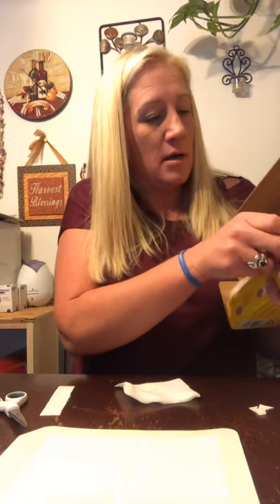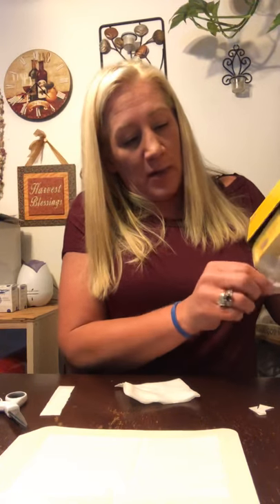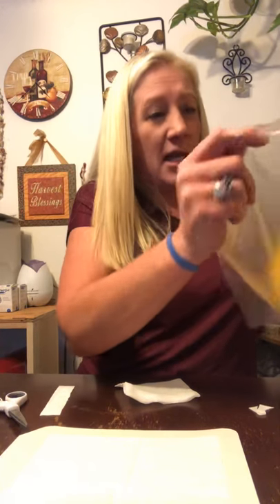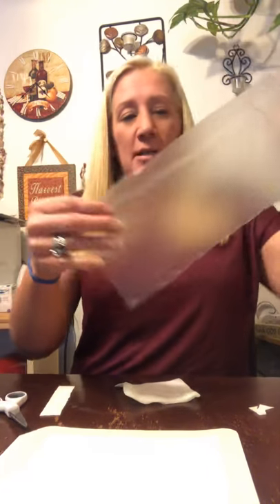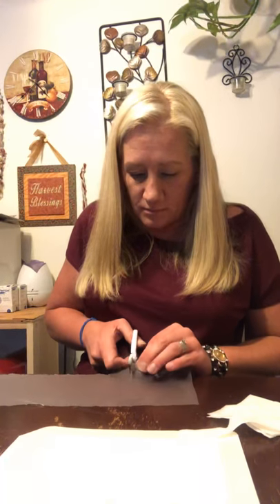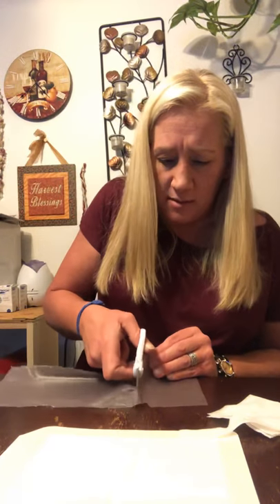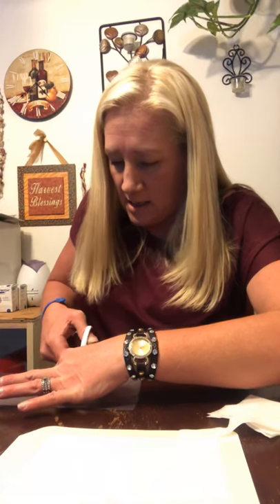This stuff lasts forever — I buy it at Costco because you can buy everything in bulk there. It came in a three-pack and it took me almost a year to use the first pack. You're going to cut off about this much and cut it into three pieces because you really don't need a whole lot. The third piece you can just stick on top of the box and save it for your next shower.